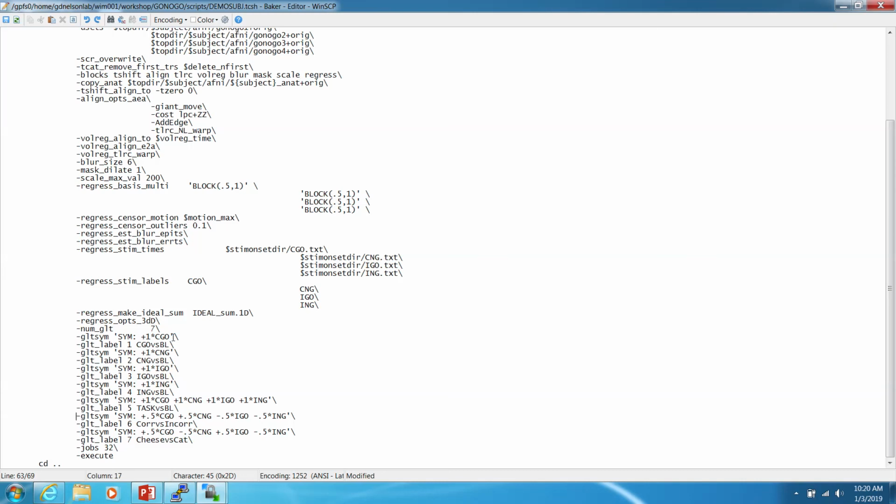And this is happening 50 times, in this particular case 50 go trials. So it's looking at what the expected response would be, and then this is the regression: the probability that what we actually saw relates to the BOLD activity in this specific voxel. And all this is other, whether it's involved in the go, no-go, or differentially involved in the go versus the no-go. So that's the essence of what this regression is.